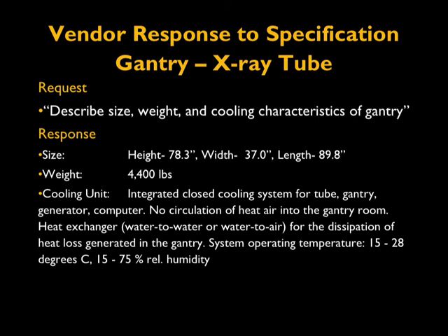Again, here the gantry weighs 4,400 pounds. That can be a determining factor in how you design moving the gantry into the clinic with movers, and at what location. The weight of the gantry will also determine where the CT scanner is located, and wherever it is located, whether the floor needs to be reinforced, etc. Again, this is another factor.